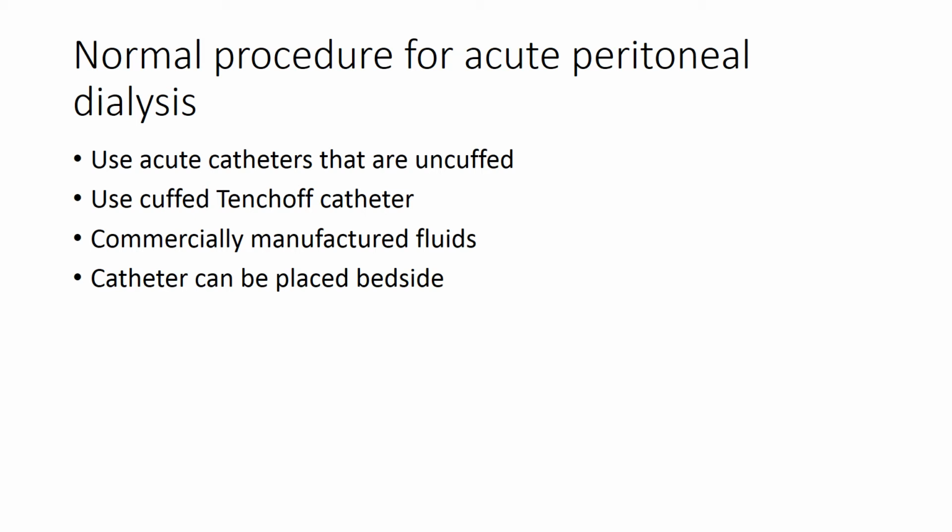And then I'm sure you've seen that we use commercially manufactured fluids which are kept in sterile bags and so on. And the ideal situation is that these catheters be placed bedside, which is what we do in our unit. When Tenckhoff catheters are available, we'll place them under local anesthesia. When it's safe to provide sedation, we'll sedate the patients, but we place them bedside.